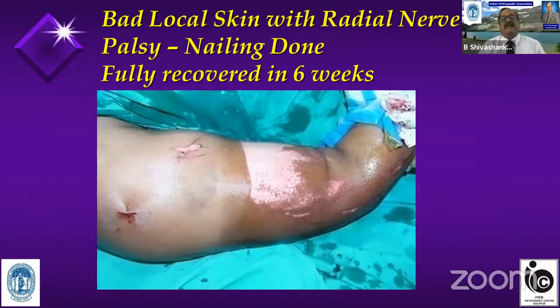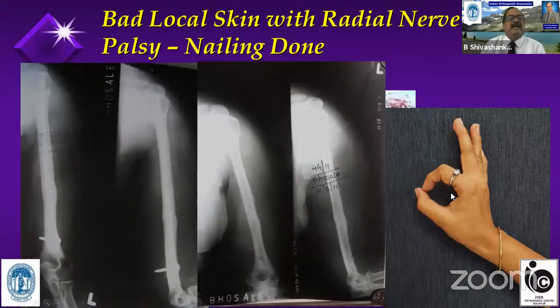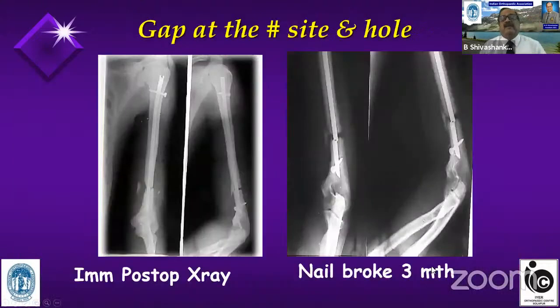This is another case. Again, you can see the patient was traveling on a motorcycle and the sari, that is the dress material, got caught in the wheel and she was thrown off, and there was a fracture of the humerus as well as radial nerve palsy. Again, I did the nailing and I have done the implant removal, as I said, and this is the clinical picture showing good radial nerve recovery.